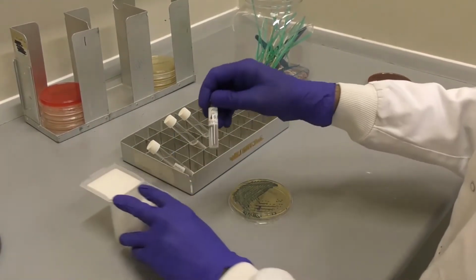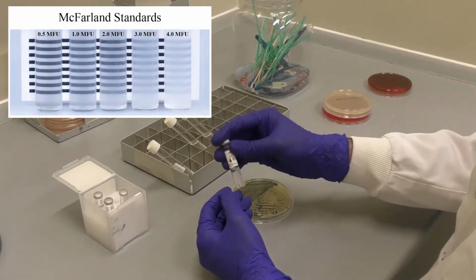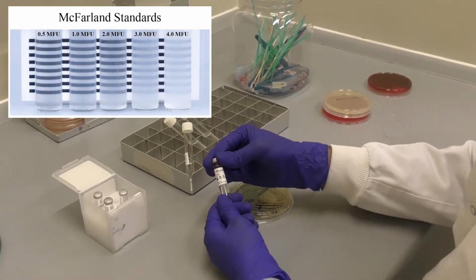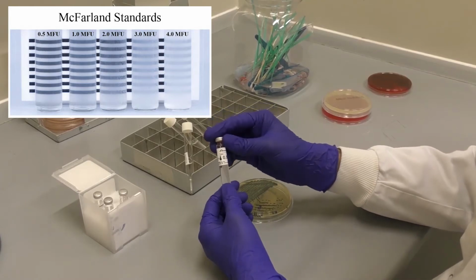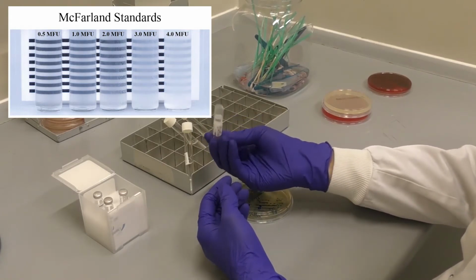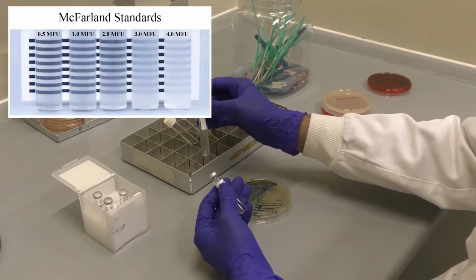In this video we have different kits available to us, but the principle is the same. Invert the McFarland equivalence turbidity standard gently to fully suspend the polystyrene microparticles, then compare the turbidity of the bacterial suspension. Note the bacterial suspension tube should be of a similar diameter to the McFarland equivalence turbidity standard tube. You need to make sure you do this in adequate light, and the match is when equal obliteration or distortion of the black lines is present.